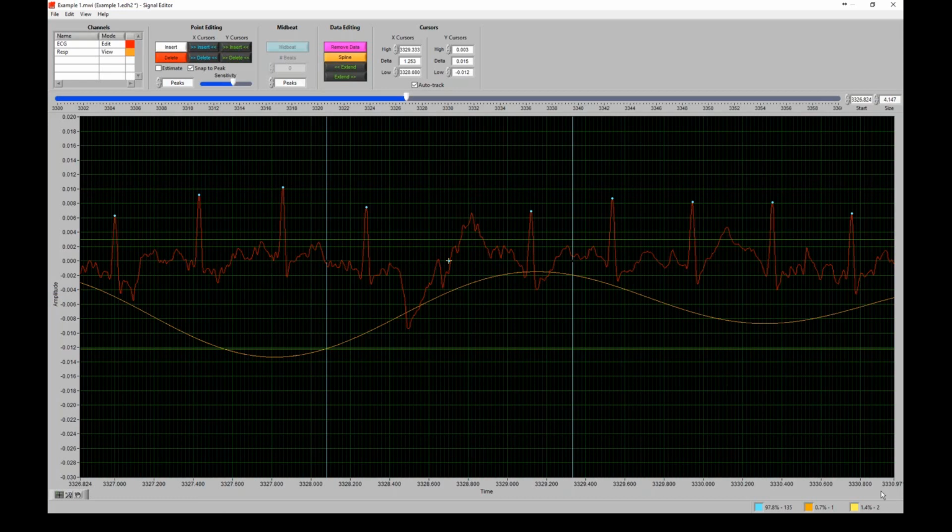And we can see it reflected down here in our point distribution. We can see that we have estimated 1 beat, which contributes to 0.7% of the total beats of this segment. So at this point, we're well under our 10% threshold. This is where that threshold comes into play. You'd want to watch that we don't exceed that. And that's it. That's what you would do when you can't tell where the R peak would have occurred, even though you know there should have been one.